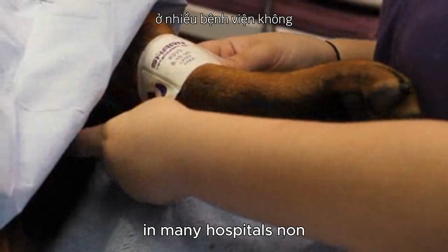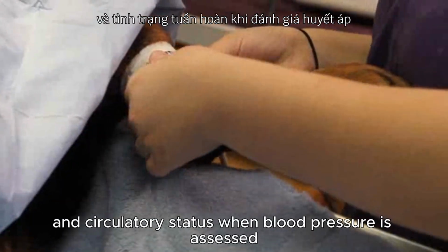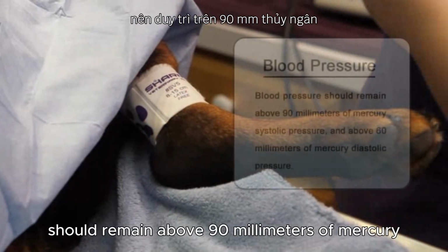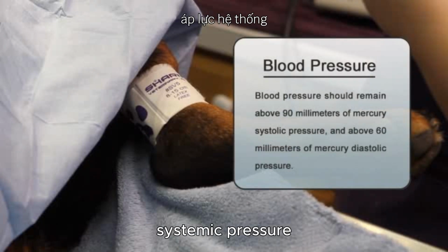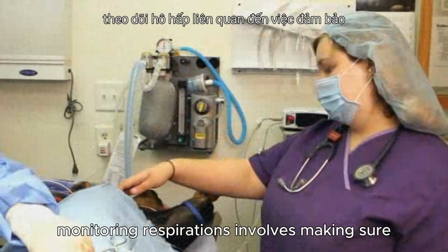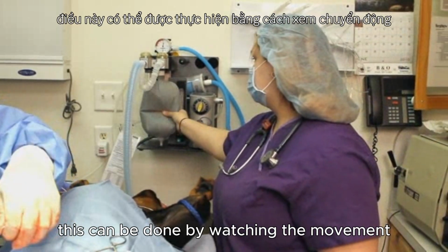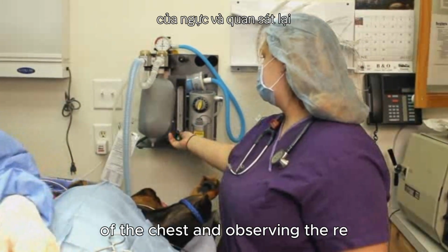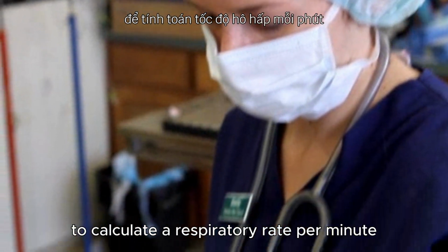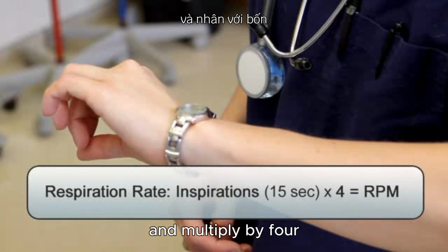In many hospitals, non-invasive blood pressure monitoring during surgery has become a valuable indicator of heart and circulatory status. When blood pressure is assessed, the patient's blood pressure should remain above 90 millimeters of mercury systolic pressure and above 60 millimeters of mercury diastolic pressure. Monitoring respirations involves making sure the patient is taking regular breaths. This can be done by watching the movement of the chest and observing the rebreathing bag on the anesthetic machine. To calculate a respiratory rate per minute, count the number of inspirations taken in 15 seconds and multiply by 4.